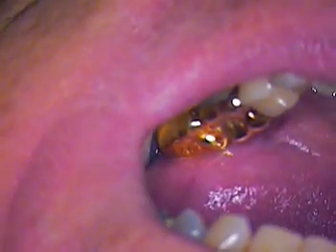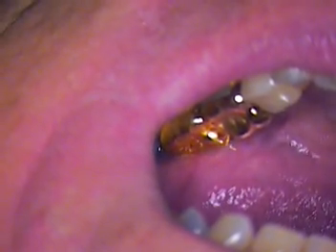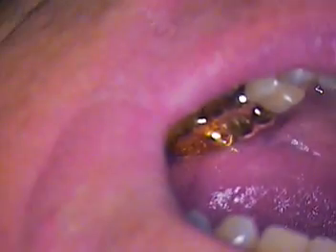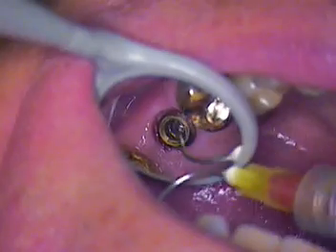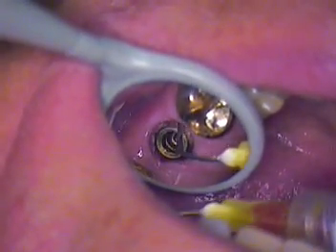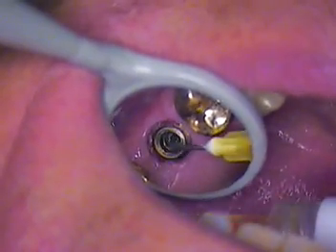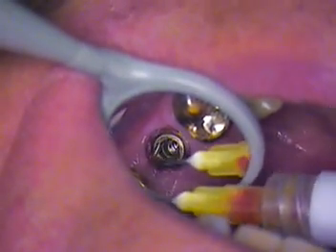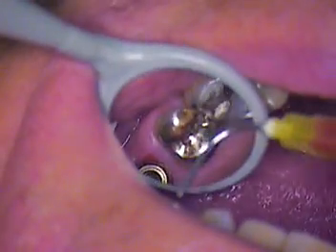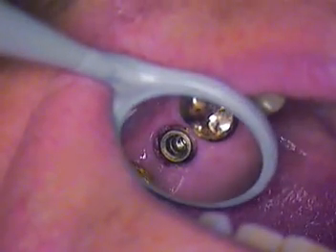On the microsuction now, we'll go back in, do the same thing with the microsuction. After the microsuction, we're going to go ahead and place our impression coping and associated cap with that. All right. We're pretty much debris free at this point. Give that to you.